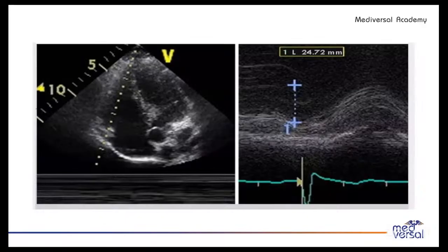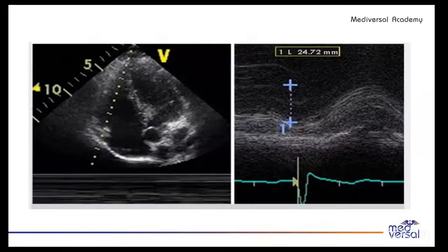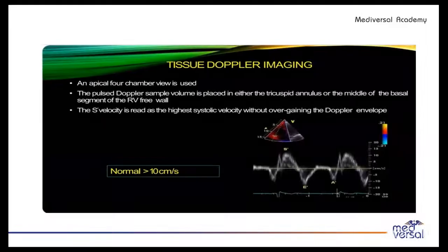Generally, when beginners go for cardiology training, we start with TAPSE for assessment of RV function. It is very easy. If one can get the apical 4 or 5 chamber view, they can easily put the cursor, apply M mode on the tricuspid annulus, and get the TAPSE.